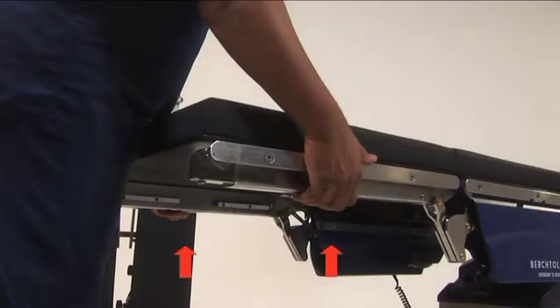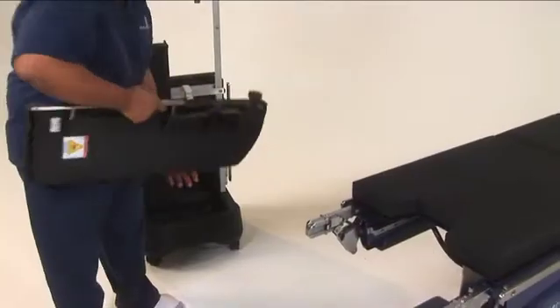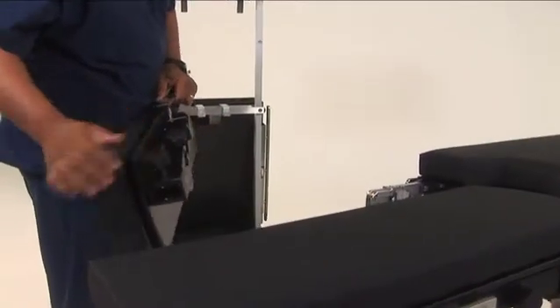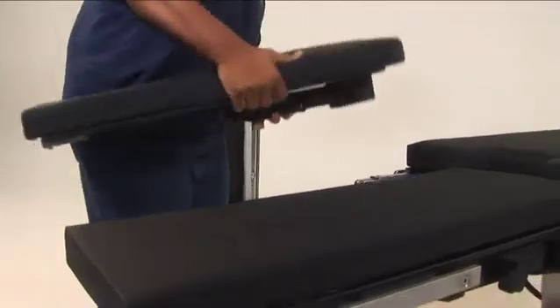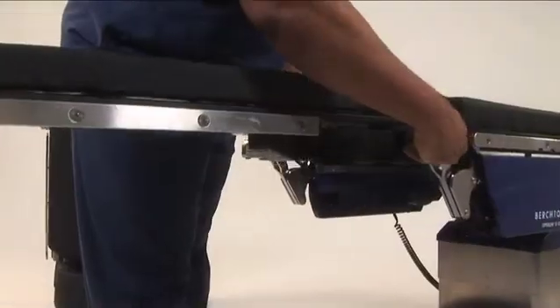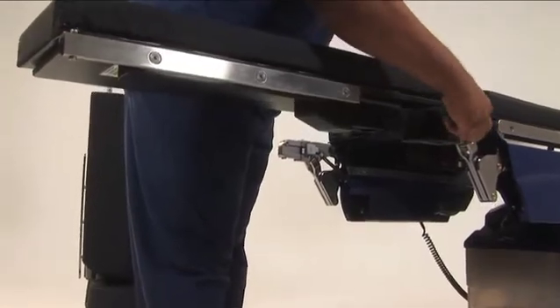Remove the leg section by depressing the spring locks underneath the side rails. First, ensure that the locking mechanism — this top knob here — is open on each leg section. Attach the leg assembly by sliding the split leg onto the table spar until the lock engages. Secure tightly with the knob.